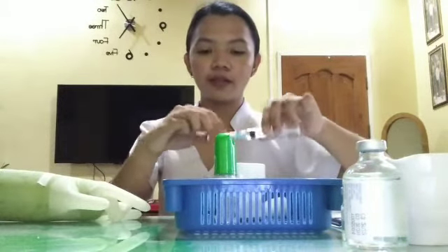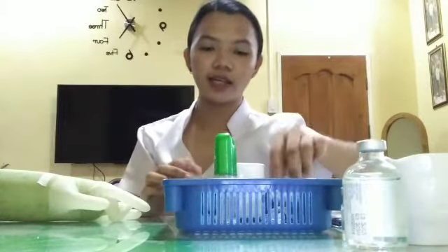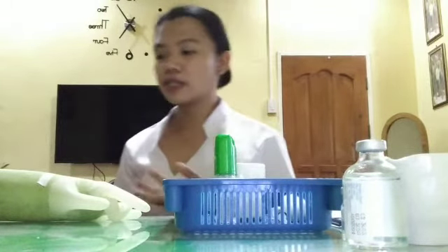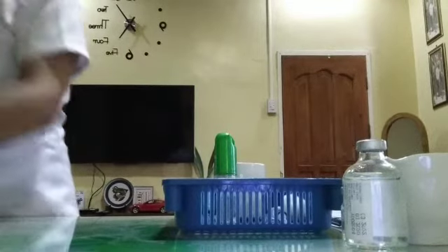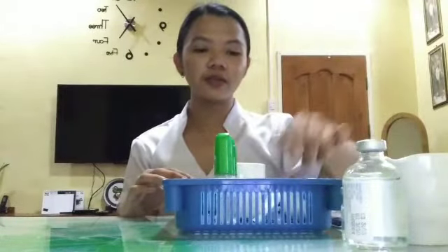And then we will put the cap back on for safety, and then we will assist the patient into a comfortable position. So ma'am, is it okay that this is your position? Okay, thank you. So thank you also for your cooperation, and stay healthy. So after that, we will gather all the used equipments, and we will discard them.